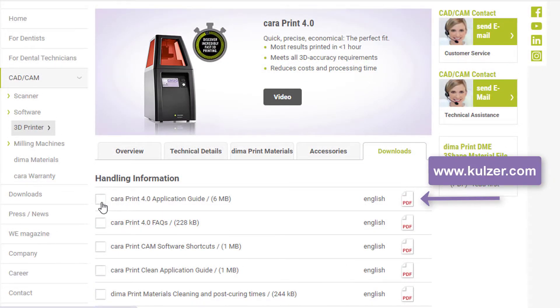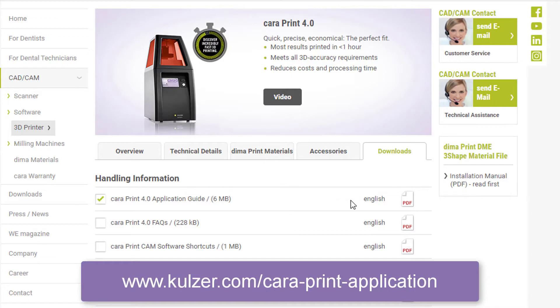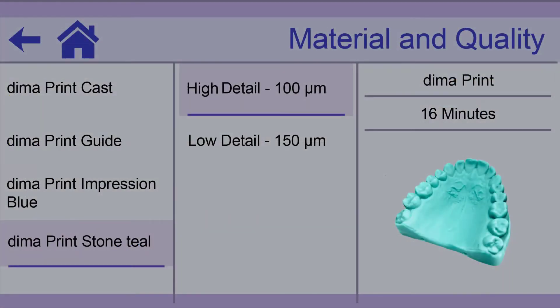Import the print files into the internal library and select the corresponding data set from the material list. From firmware version 70, a material data record for DEMA print stone teal is available.